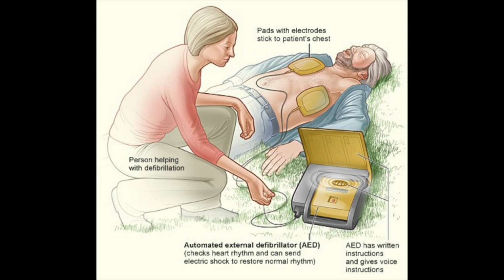If there are two trained rescuers, one performs CPR while the other prepares the AED for use. The rescuer in charge of the AED will apply the pads around the hands of the person giving chest compressions. Do not stop CPR while the AED is being readied for use. The AED will prompt you to stop CPR when it is ready to analyze the heart rhythm.